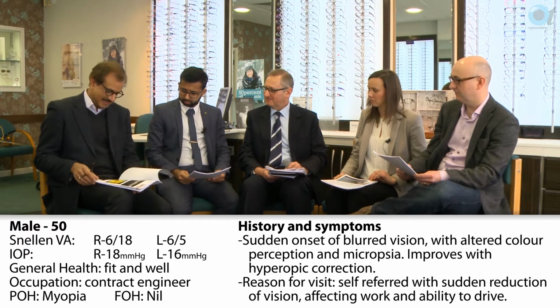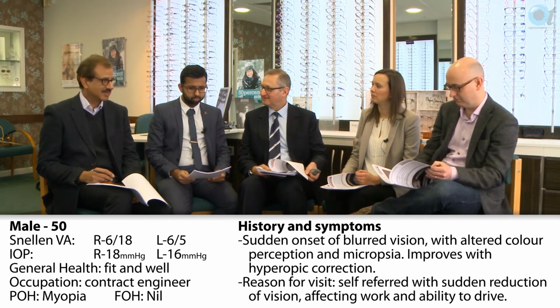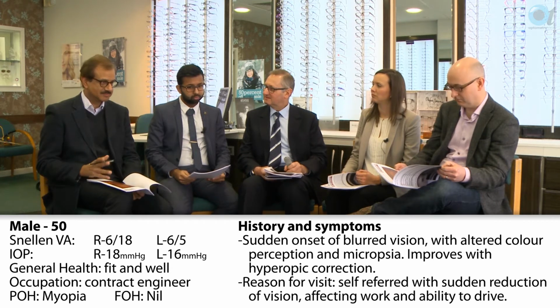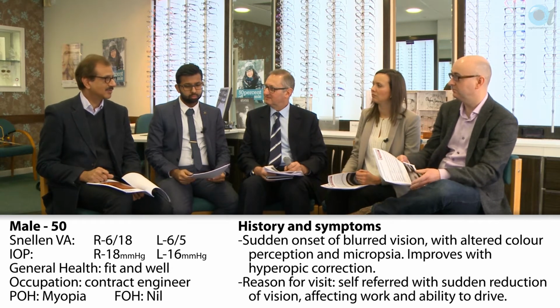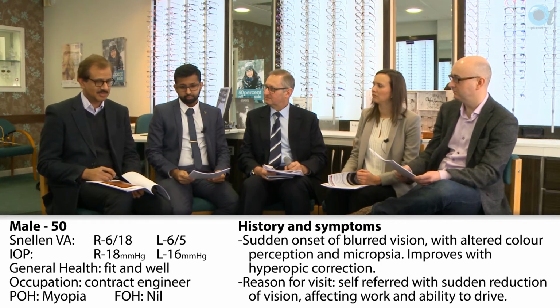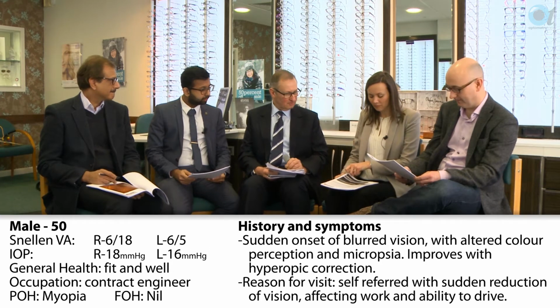However, going down the list a little bit, differential diagnosis starts to worry me. I'd be starting to worry about other things similar to central serous chorioretinopathy that this could be. Okay, has anybody else got any other observations?